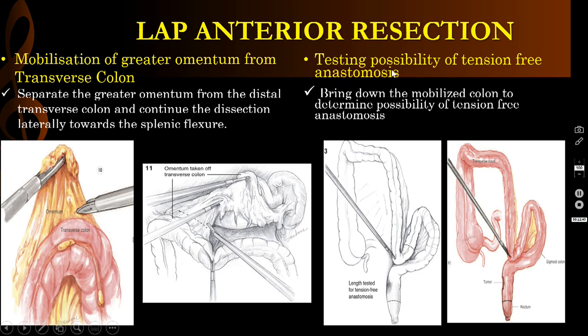Now you have to test the possibility of tension-free anastomosis by bringing down the mobilized colon. So you have to bring down here and see whether it is coming down easily, so that you can make an anastomosis without tension.